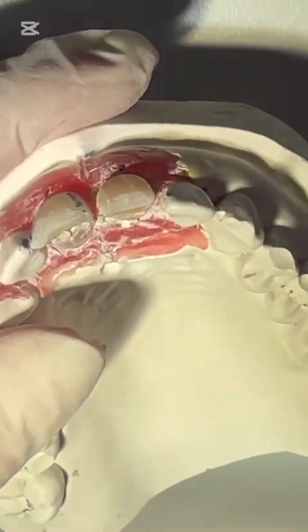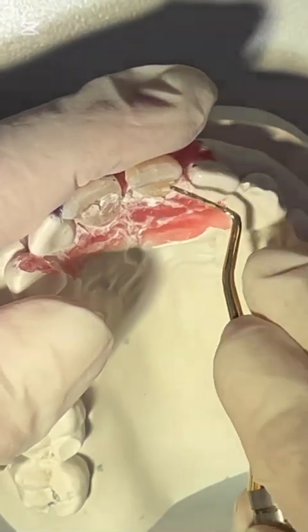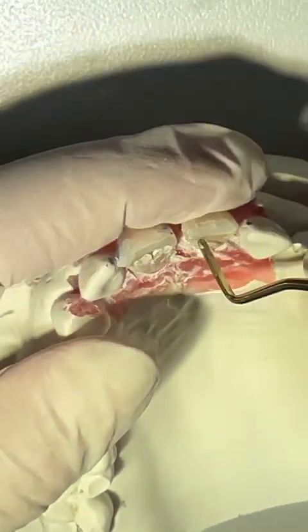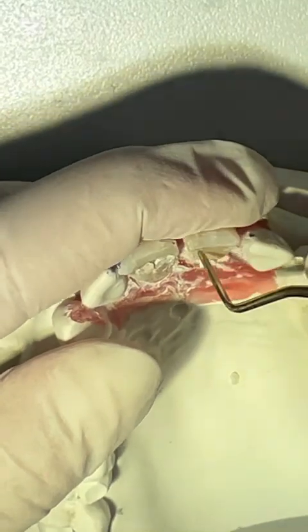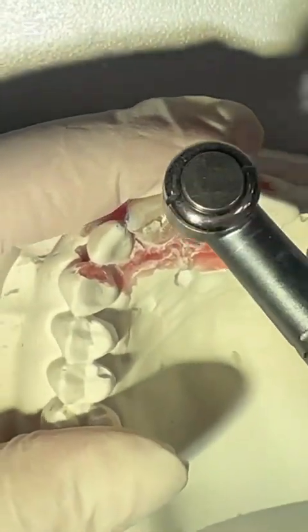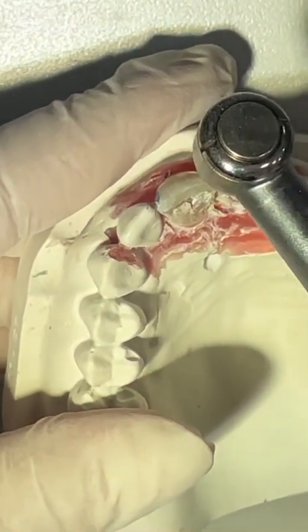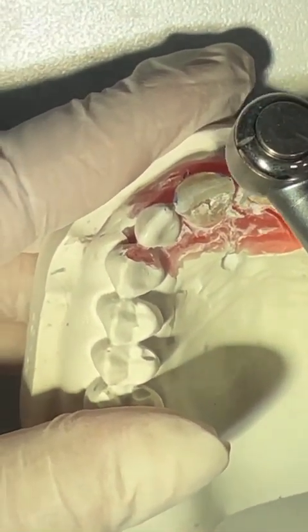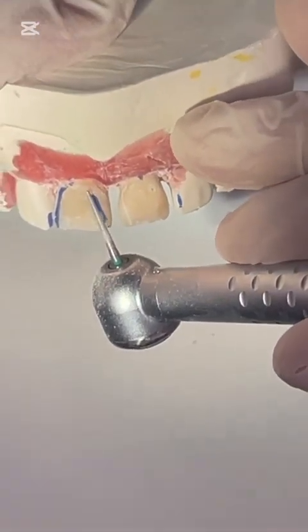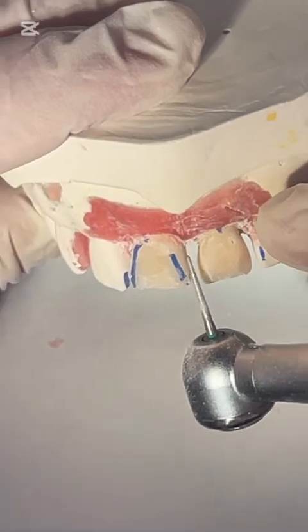I will remove the rest of the other two, the same. Beveling.